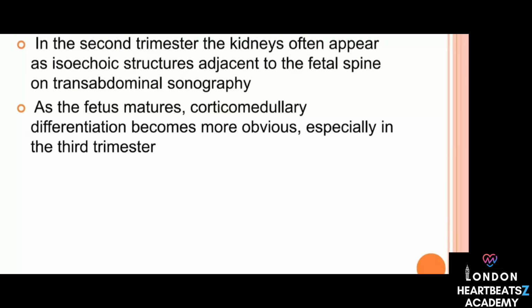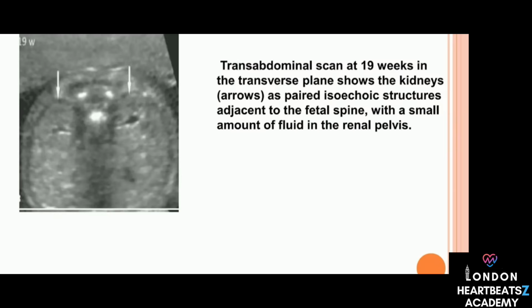Yes, renal lengths are a standard measured parameter. The source actually provides a table listing normal fetal renal lengths ranging from 14 all the way to 42 weeks of gestation. Oh, a reference chart. Exactly. This highlights the importance of comparing the measured kidney length against these established norms for the specific gestational age to assess whether the kidneys are growing appropriately.